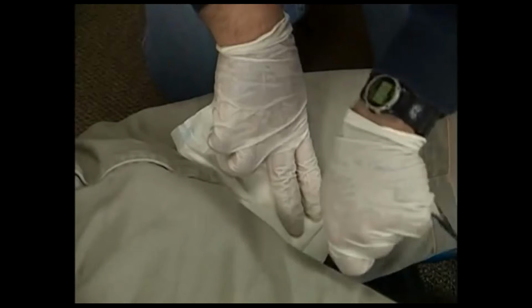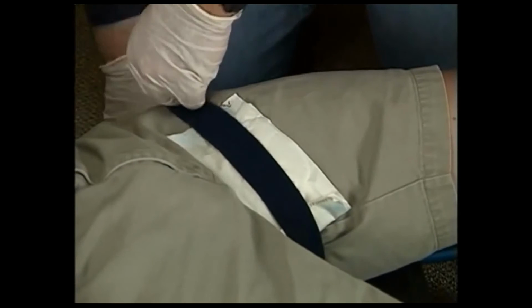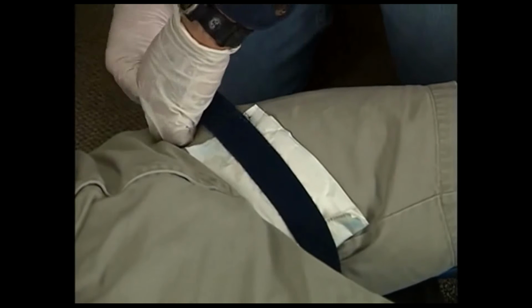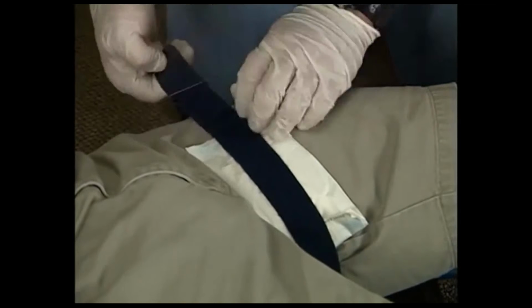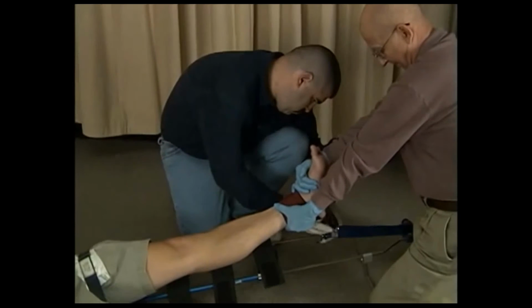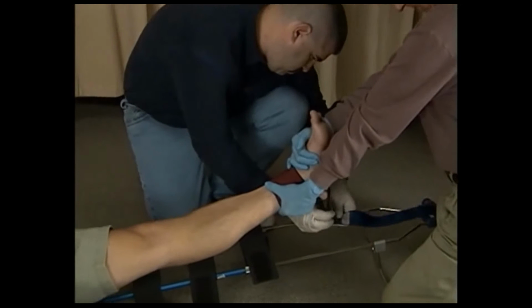Apply the ischial strap securely. Fasten the ankle hitch to the splint and apply mechanical traction.